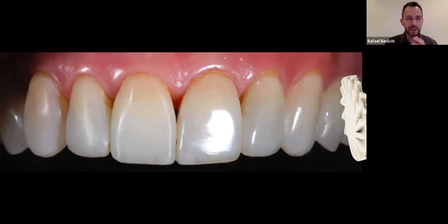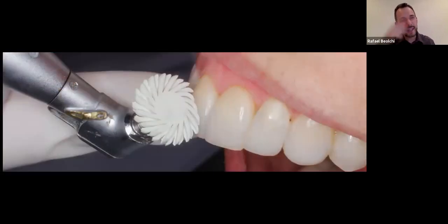Pressure. So there's 2 things we need to take control when we're using silicone points. Speed, as I said, under 10,000 RPM, and pressure. Pressure, I cannot tell you guys how much. It is a light touch. With spirals, you can never put too much pressure because the spiral acts as a shock absorber. So we can see here the bristles absorbing the pressure I'm applying there. So this helps us in getting a faster luster, a faster finishing.